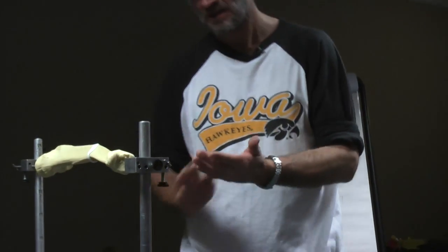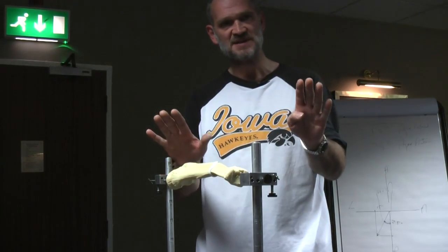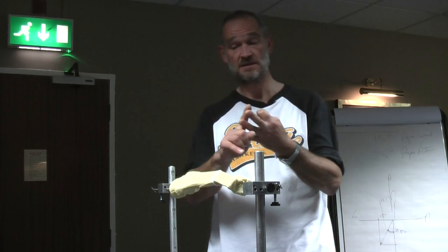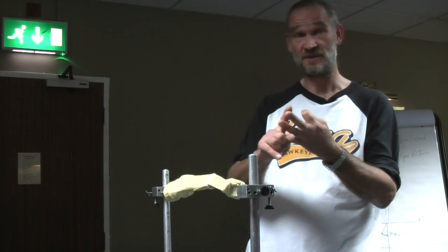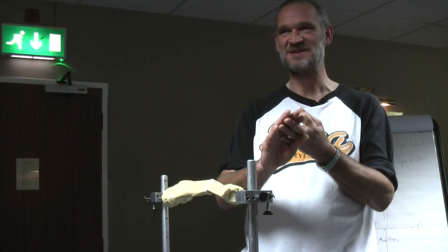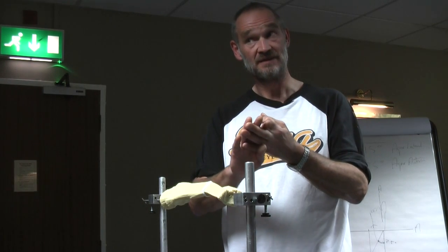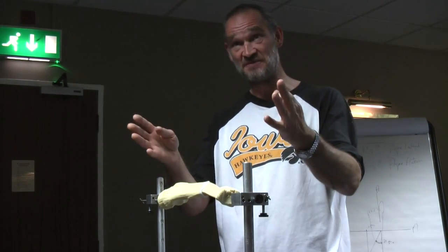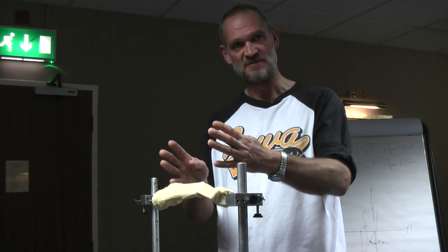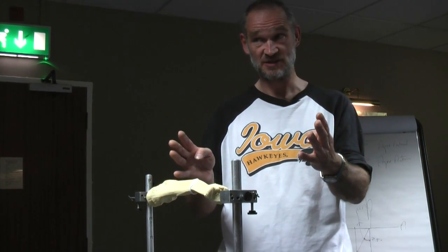Ordinarily, being where I am, what I do and all that, the frame for any tibial correction would have 4 rings and 10 Ilizarov wires, 10 wires. I'm given to believe you can use half pins. Right, I hear a rumour that says you can use half pins instead of all wires. And given that we've got an hour to do this, and that you guys want to spend your time doing it rather than watch me doing it, we'll put some wires in, we'll complete the frame off with some half pins, just in the interests of speed, for my demonstrating it to you guys.